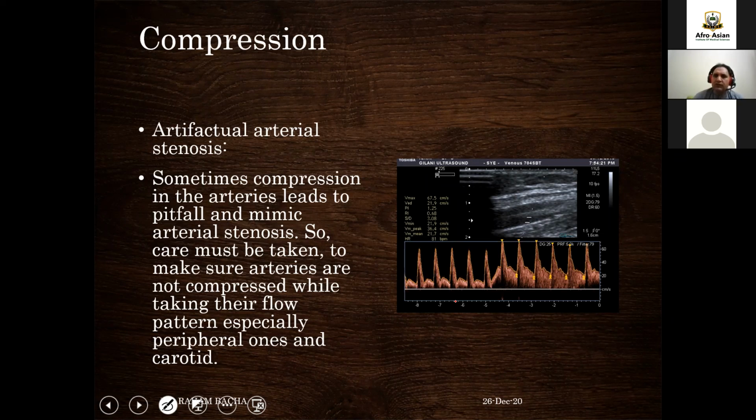Because sometimes while localizing the vessel, talking about arteries, some arteries are too hard and cannot be compressed, but with an excessive amount of pressure, arteries could also be compressed, and there will be artificial stenosis, with its characteristic findings.